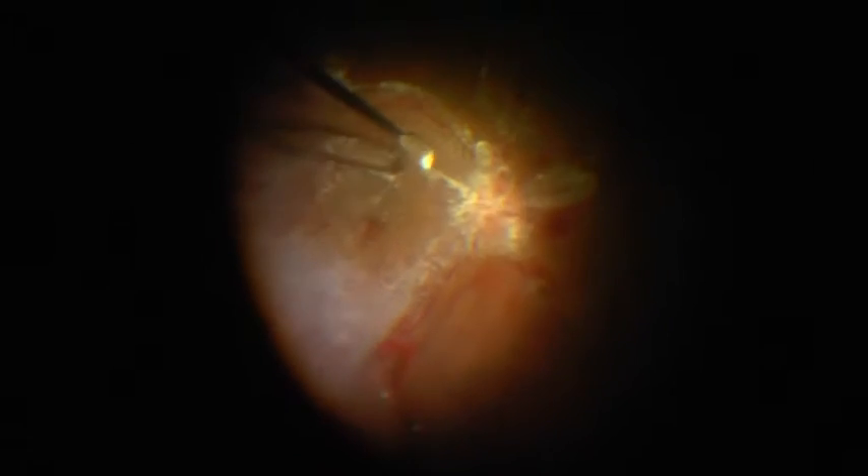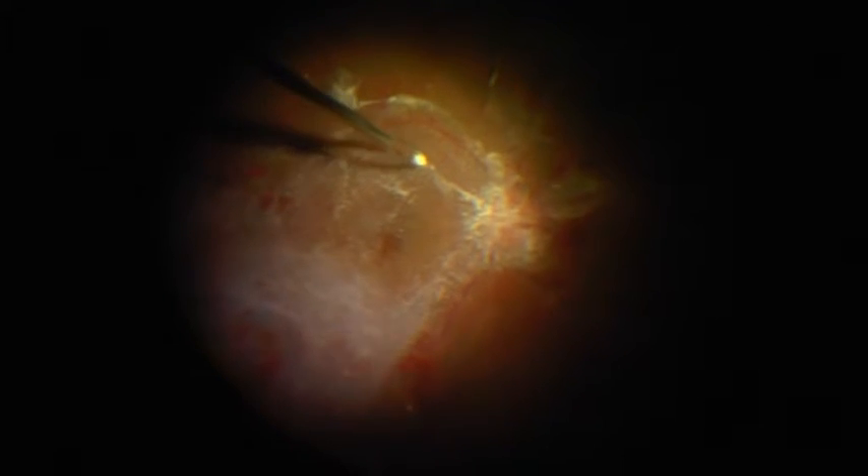What we see here before us is an extensive vitreoretinal adhesion with the posterior hyaloid almost impossible to separate. Upon pulling the vitreous, the posterior hyaloid keeps splitting. Trying to hold it from beneath the hyaloid doesn't seem to work too well either. Also, the slightest traction causes the new vessels to bleed.